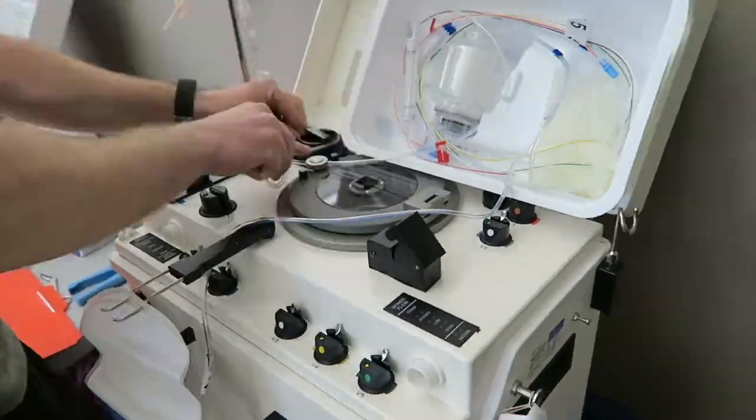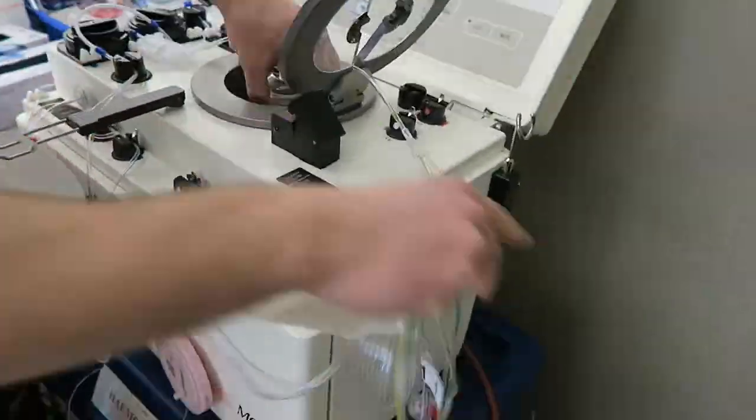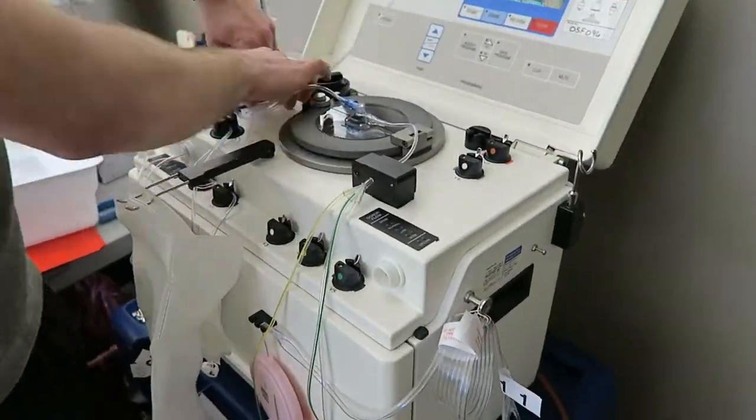I'm going to skip quickly through this part, but this is interesting — this is a machine I get hooked up to when I donate blood. I have O negative blood, which is the universal donor blood, meaning anyone can receive it. So I go through a slightly different process, but other than this machine, the rest is pretty much the same.